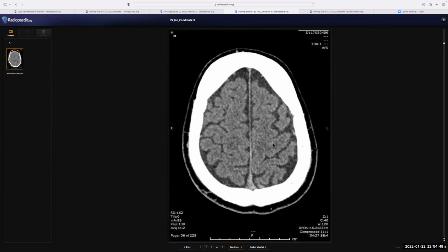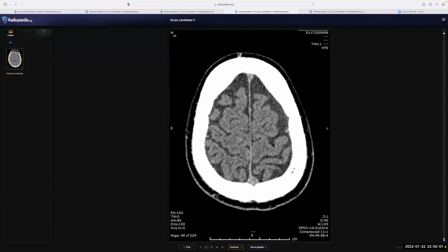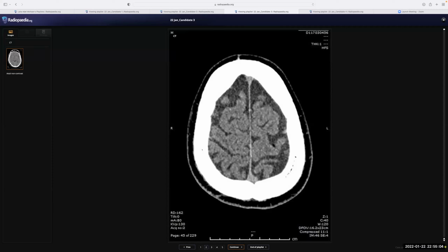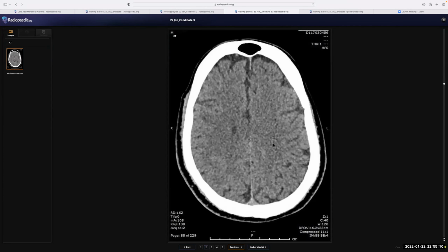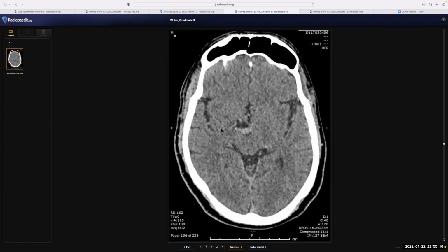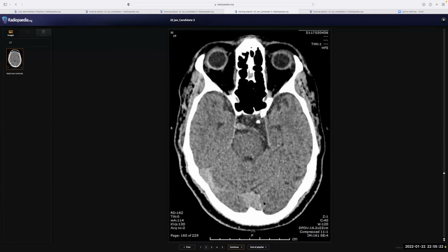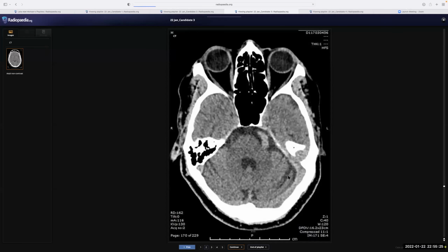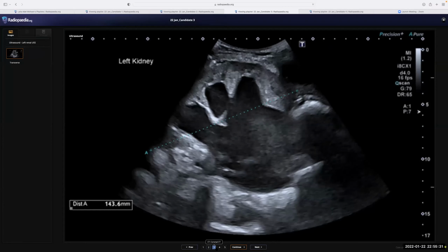One more thing, whenever we are discussing the case, so this is a sequence, and the examiners and even the invigilators will tell you, do not scroll until you are told so. Whenever there is a scrollable image, they will tell you to start scrolling. Take it easy. Tell them whether you are scrolling in a craniocaudal fashion or a caudocranial fashion, and speak while you are scrolling so that your eyes take time to see the whole sequence. Don't just focus on the abnormality and leave the rest of the sequence. Not specifically in this case; I will show you in one of the cases.